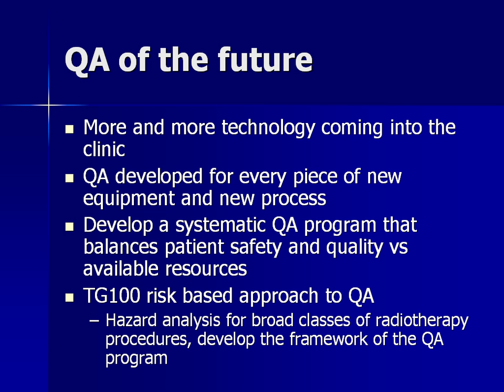Yeah, Mary, there was the ASTRO meeting in the fall of 2005, I believe it was. It was a very interesting paper that was presented by somebody from the UK, where they looked at various kinds of risks that you try to mitigate by doing QA, and estimated the cost of the consequences of not doing QA.